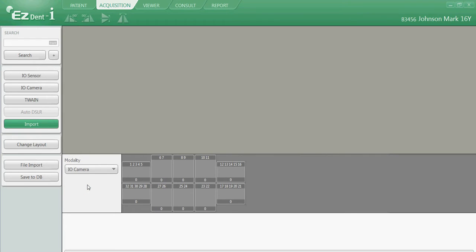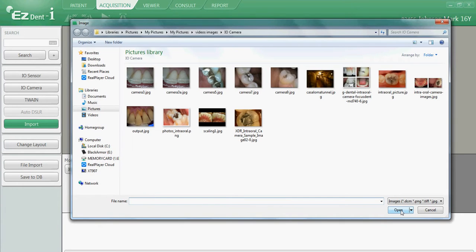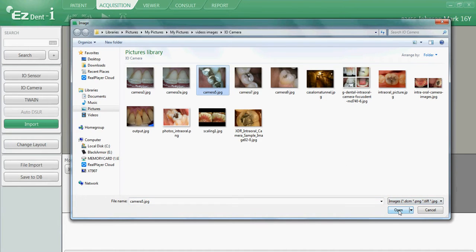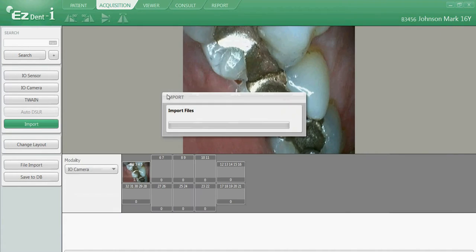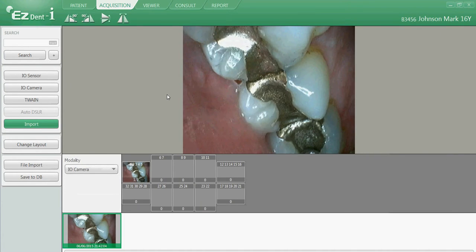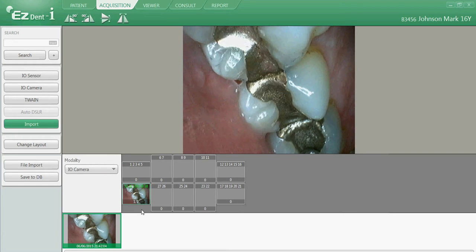From here, we have one of two ways that we can import our images. We can left click on File Import, click on the image, and then click on Open. We can then specify which mount we want to keep this image in, or we can left click and move it to another mount.